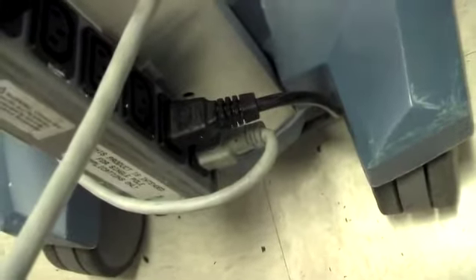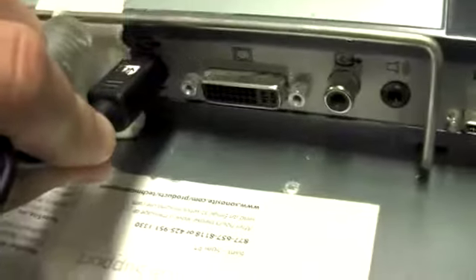When people call me from home and the machine doesn't work, I check to make sure that this is plugged in right here, and that these other two connections are also plugged in. This one is to charge the battery on the machine, and this one right here, if you follow it around, is for the iRecord device. The iRecord needs power, and the machine needs power to charge this battery between exams. So you can't record unless this is plugged in here and into the wall. And once again, the S-video cable coming out of the back of the machine should be snug in its spot, and we have the memory stick coming in through this USB extender.